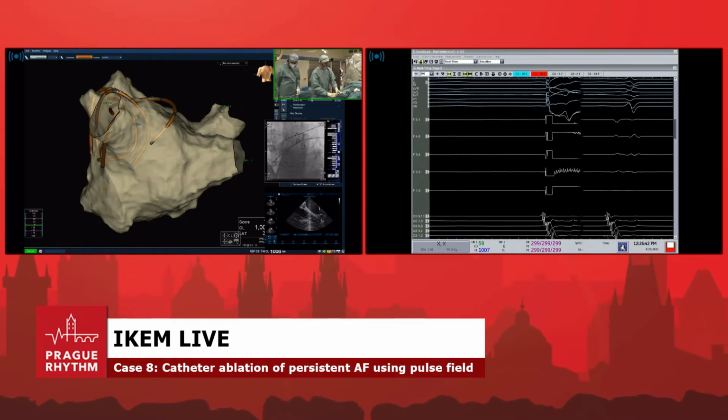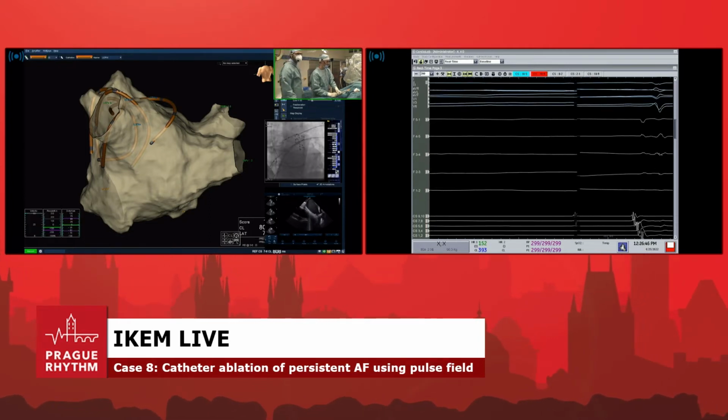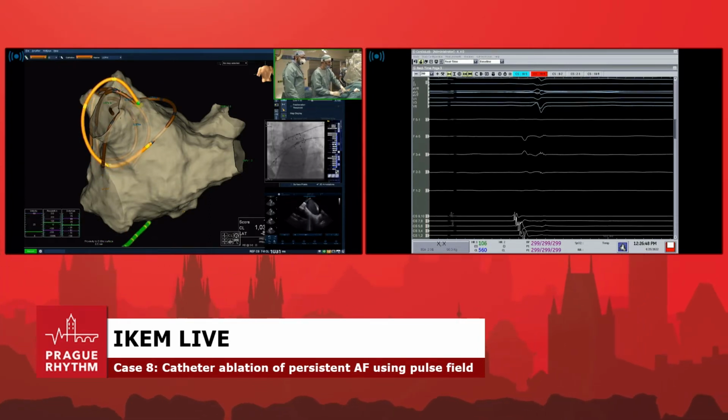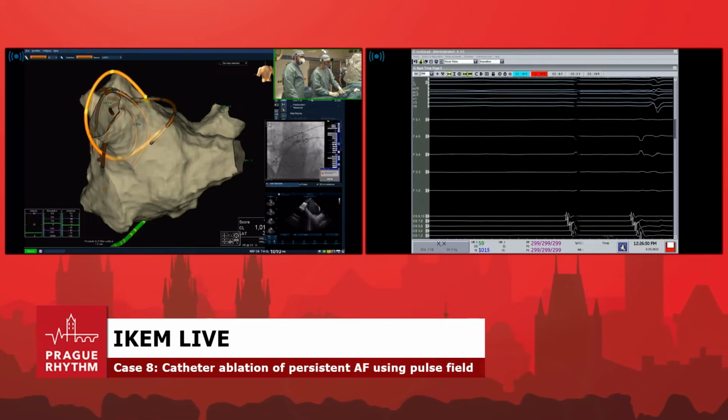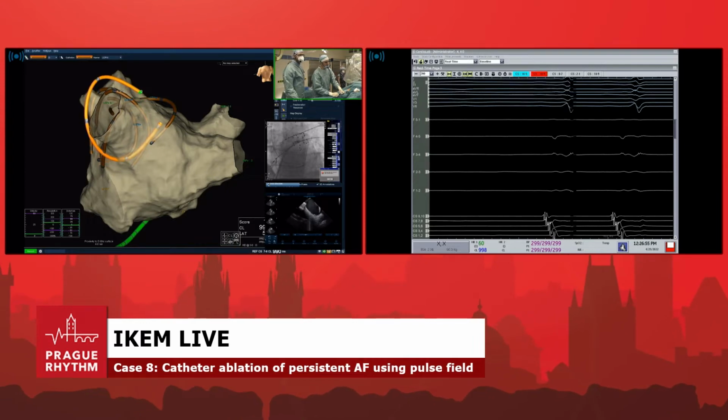Good. Okay. From here, we come back, we rotate a bit, flex the catheter, and direct it toward posterior. Okay, Jan, are you ready to take the shadow of the?